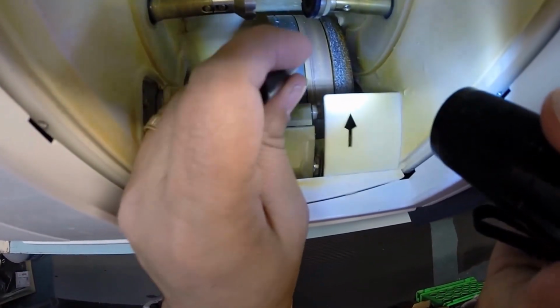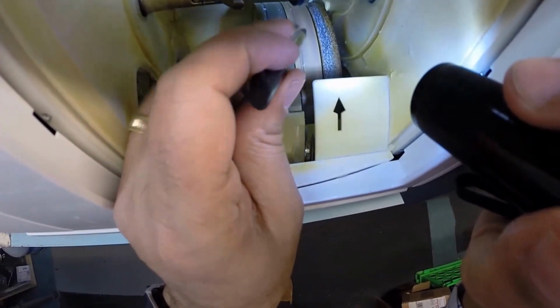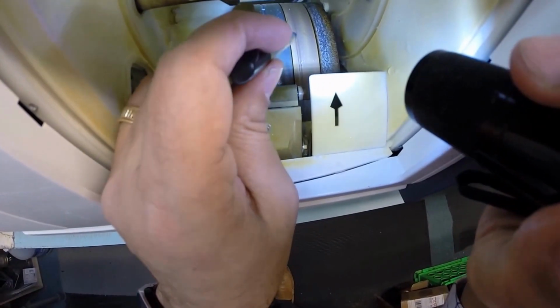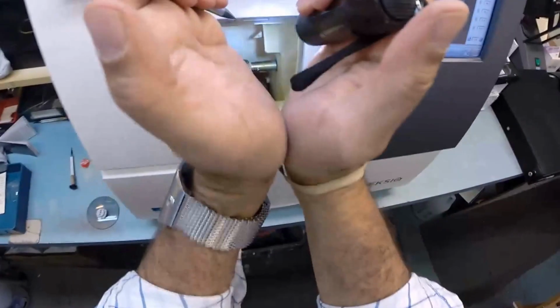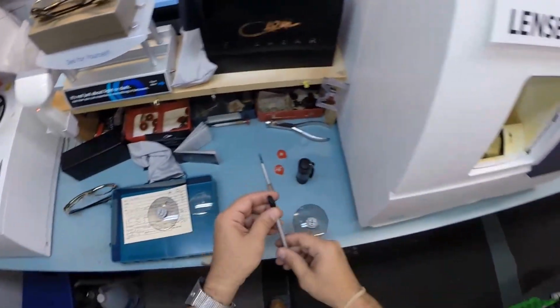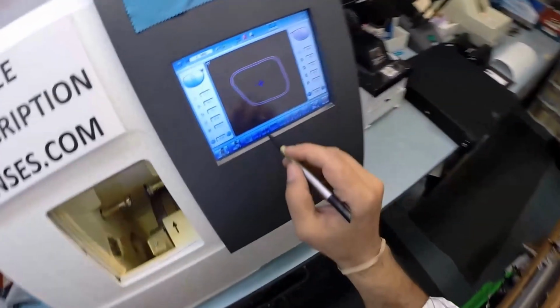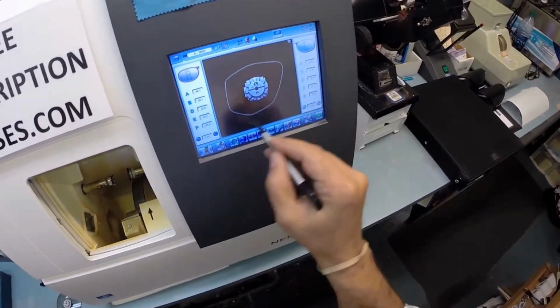This wheel in the center is like a heavy grit sandpaper to grind away the lens material until it's the final size. This wheel in the center of that channel, that valley that the stylus is in, is going to put the V-shaped bevel onto the lens. And let's go ahead and begin. Actually, let's pull up the lens on the computer. That is the shape of the lens we'll be cutting.